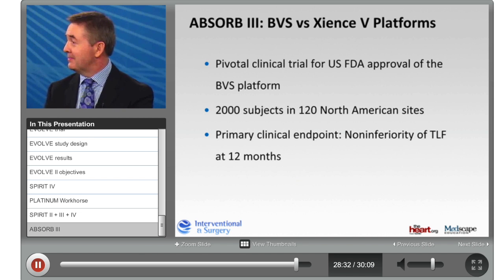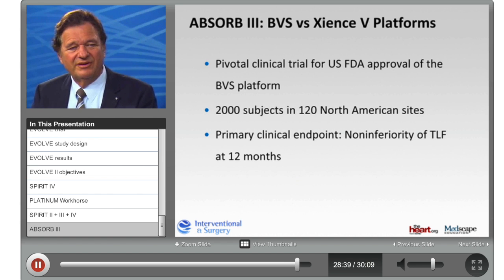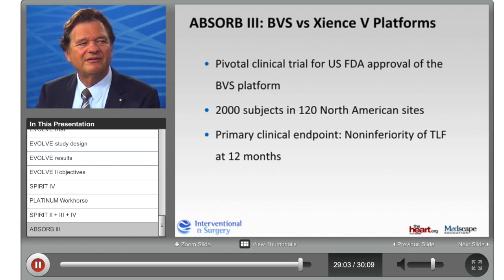Yeah. Sigmund? Yes. Well, we've come a long way: stenting, bare stents, drug-eluting stents. Of course, I would rather prefer to implant something which is disappearing. The problem we have is that to answer these questions, it may take 4 or 5 years, but I have to make today's decision already. So we have to have the guts to implant something in the patient, and we know that the data is coming out later. But we did this before, so I think we were pretty safe this way.